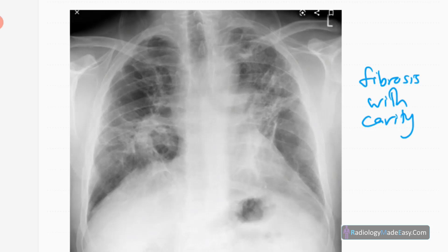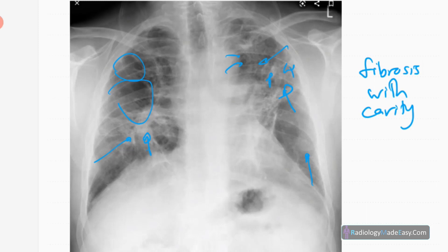This next case is more advanced than the previous one. There is fibrosis and volume loss in the lungs — the diaphragm is shifted upwards. You can see cavity formation and traction bronchiectasis with fibrotic areas. Basically there is volume loss and cavity formation, which is typical post-primary TB. There is no active infection in this patient.